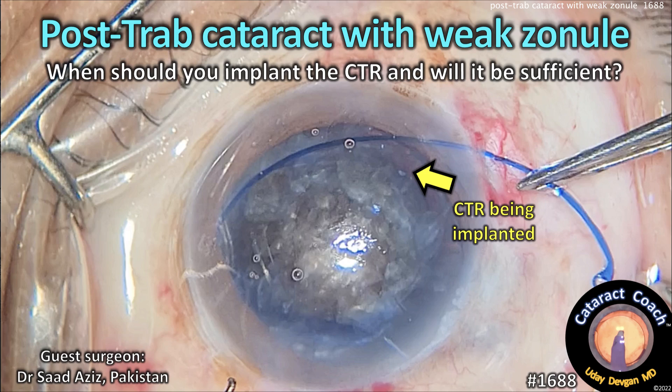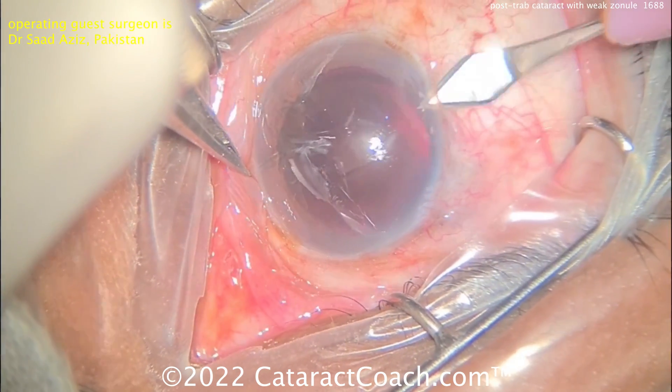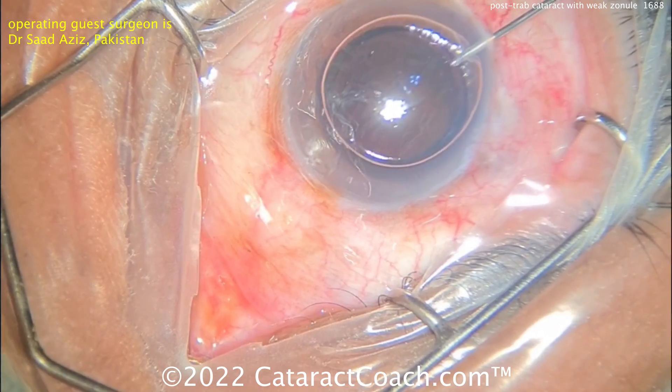CataractCoach.com — post-trabeculectomy cataract with weak zonule. So when do you implant that CTR and will it be sufficient? We've got a video here of a patient with a prior trabeculectomy and a non-functional bleb. These patients with prior glaucoma issues and prior surgery can often have weak zonular support.